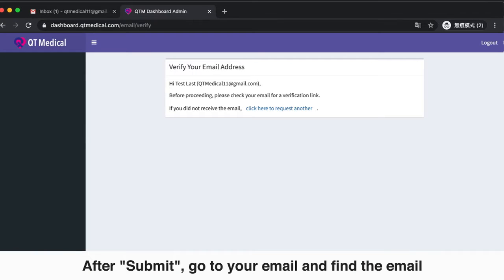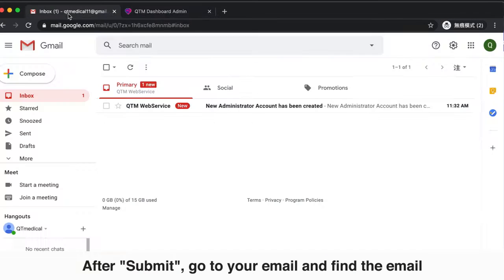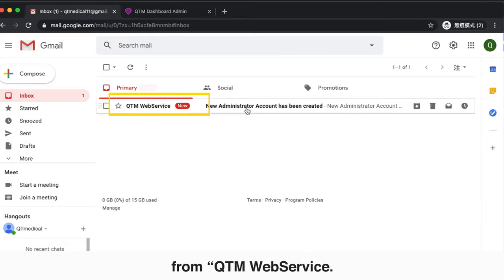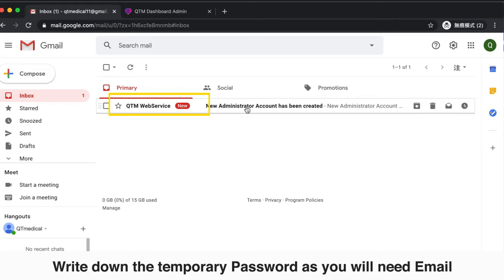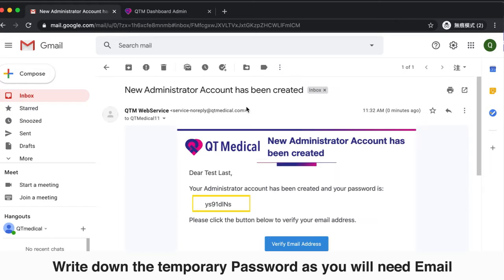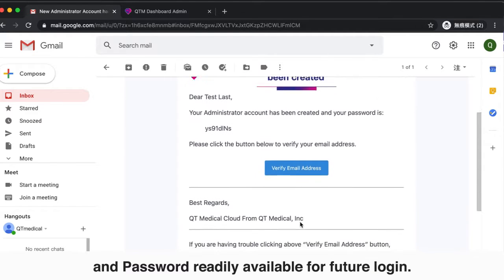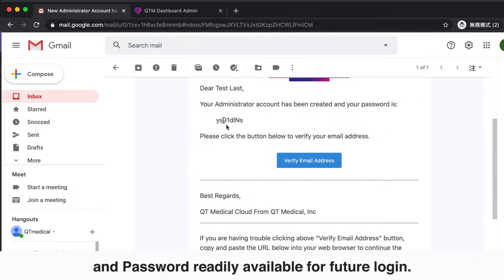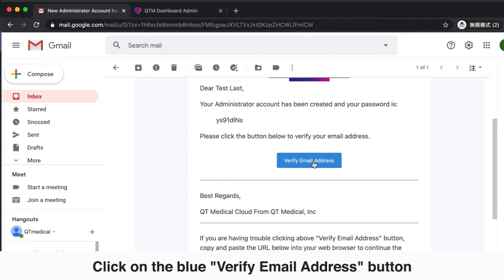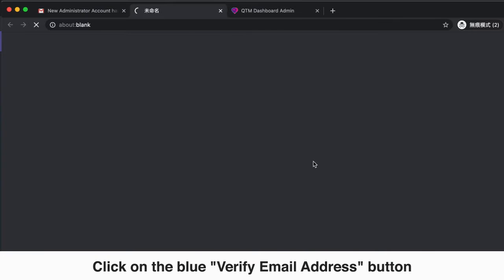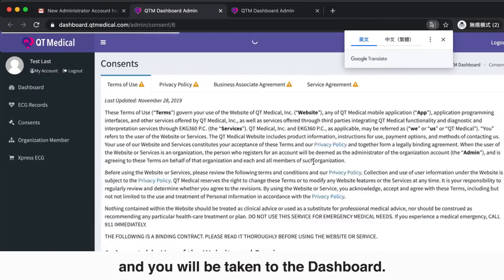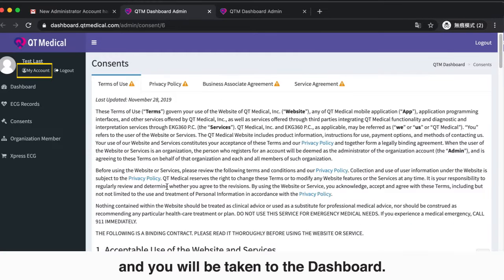After you submit, go to your email and find the email from QTM web service. Write down the temporary password, as you will need your email and password readily available for future login. Click on the blue Verify Email Address button and you will be taken to the dashboard.